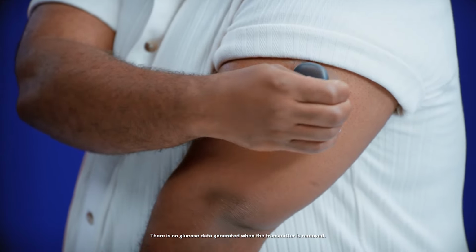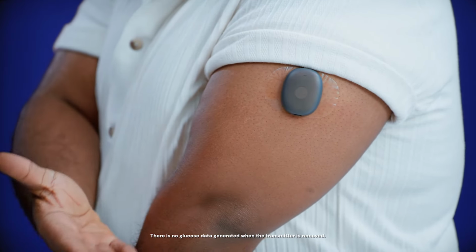First, you stick it to the backside of the transmitter, and you slap it up on top of the sensor, and you're good to go. So all you would need to carry with you, if you went away for a weekend, is 3 adhesives that are just about the thickness of cellophane tape, right? So real small, real easy to move with you.